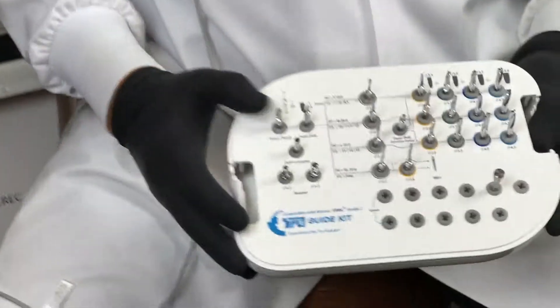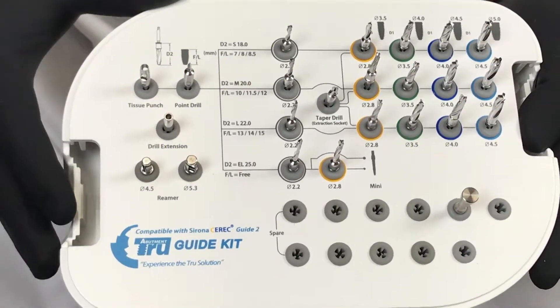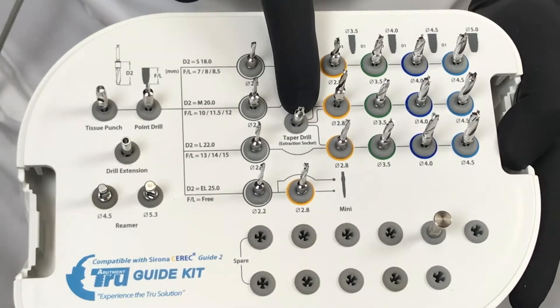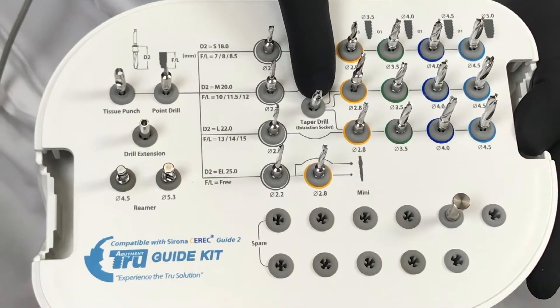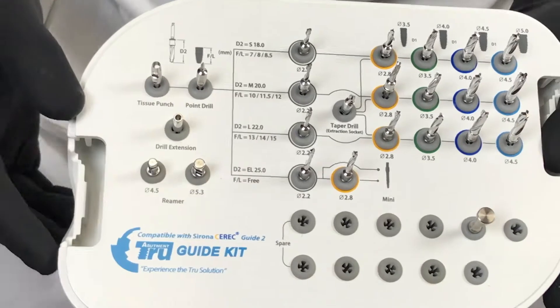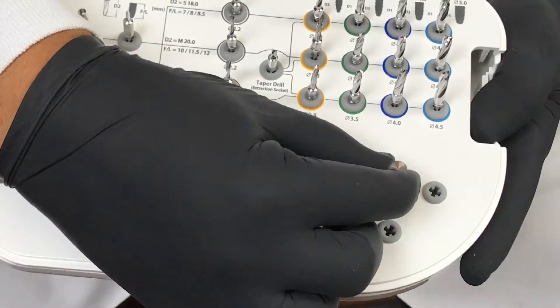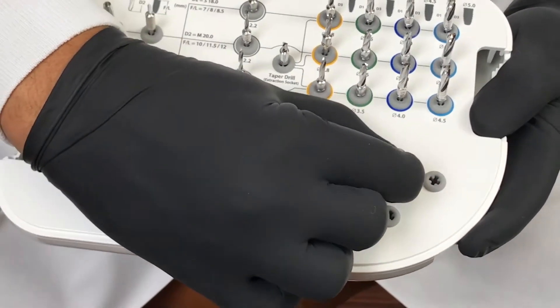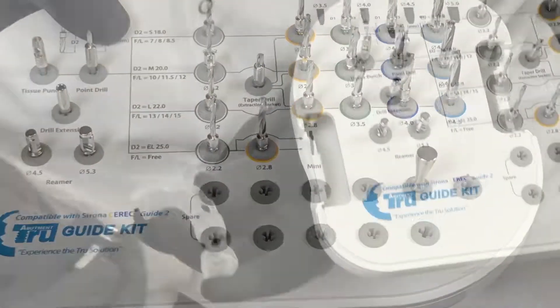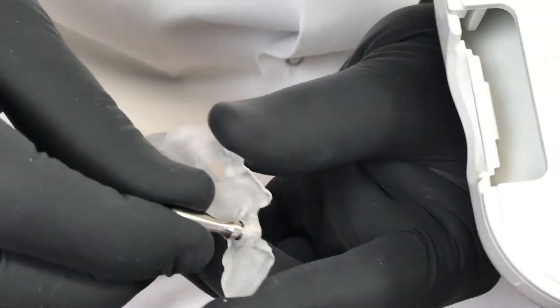This is the new True Abutment Kit for the CEREC Guide 2. They added a few things that I really like. We still have our tissue punch and the point drill, and they added the tapered drill. This tapered drill is what we use in extraction sites. They also added two new 25-length D2 drills and the 4.5. Also, there's a little tool that comes with it to position and place our metal sleeve on our surgical guide.